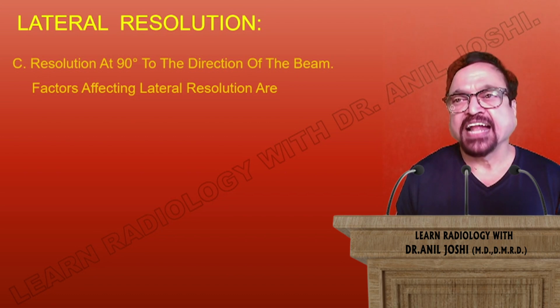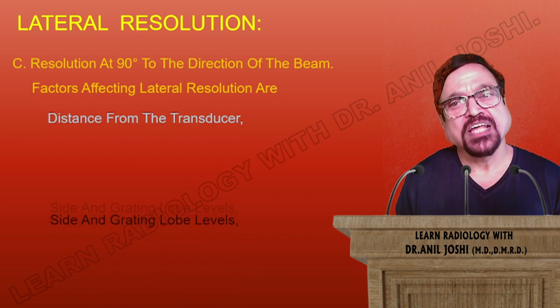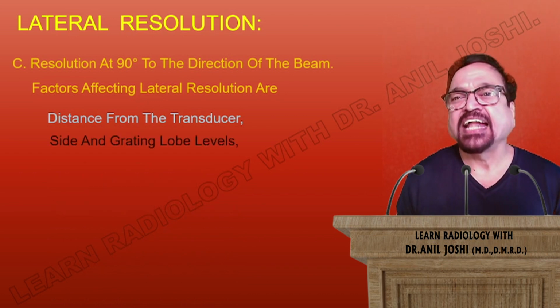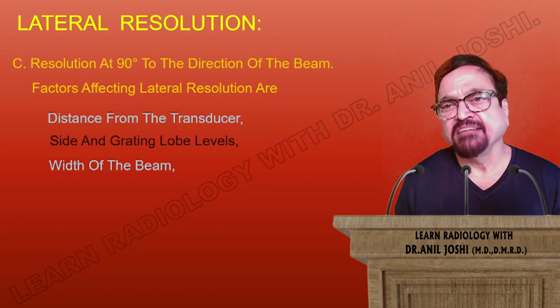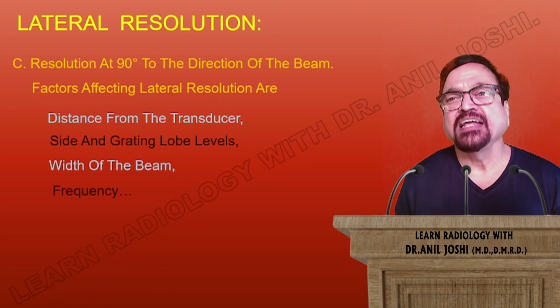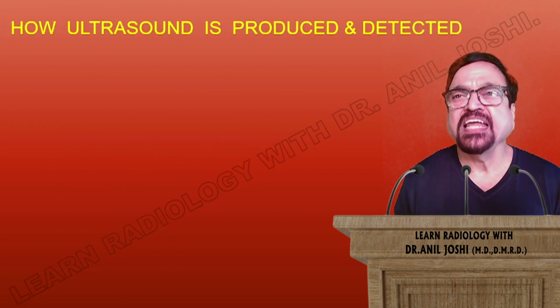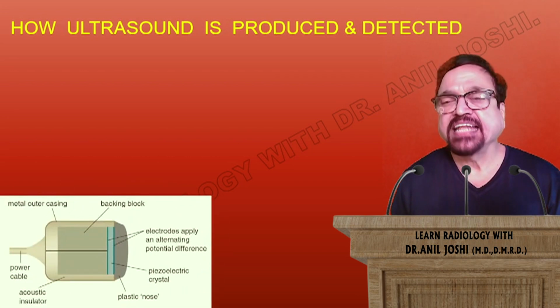Factors affecting lateral resolution are distance from the transducer, the side and grating lobe levels, the width of the beam, and frequency. These are the things which decide it. And now we'll see how the ultrasound is produced and detected.